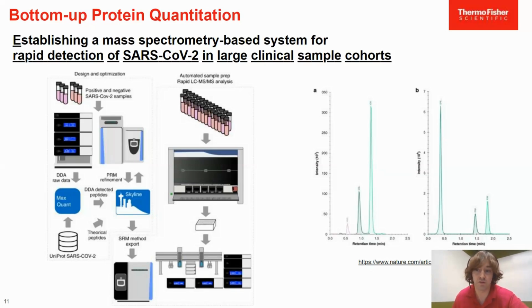The method was also demonstrated to not detect peptides in clinical specimens from other coronavirus strains, rhinovirus, enterovirus, and influenza viruses, which suggests that there's no assay interference. In addition, utilization of a multi-channel Thermo Scientific TLX4 allowed significant throughput, with over 500 samples able to be run within a 24-hour period.